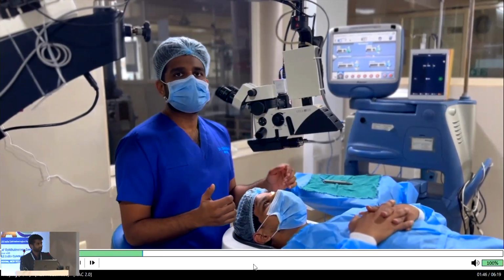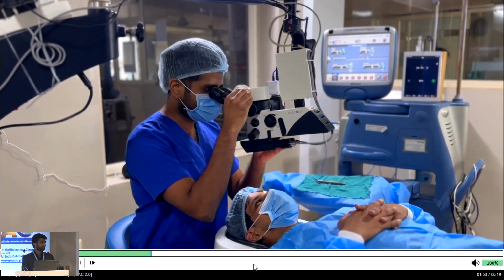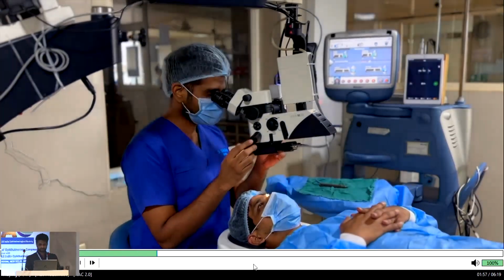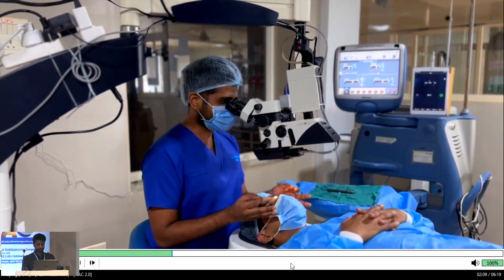So here I am simulating a surgery, and to cut the glare from behind, I use this command. Alexa, turn off backlight. Okay. This turns off the light that is causing a retro illumination.